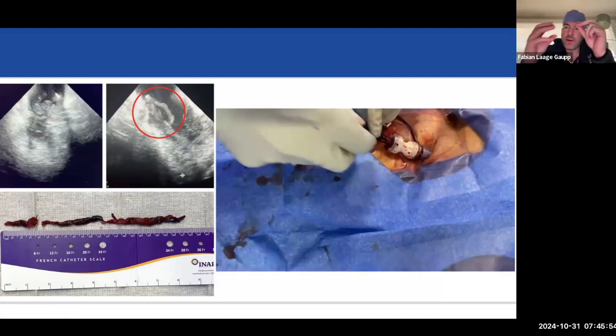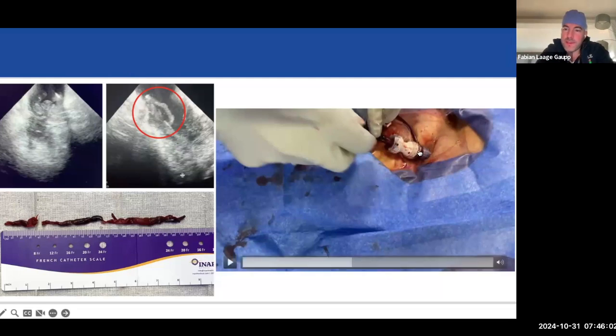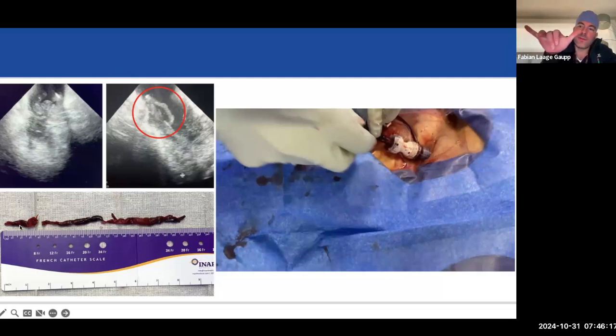it's not going in through the catheter, and your catheter just kind of latches onto the clot. So then you have to pull everything back together and then try to pull it out through the sheath. But sometimes the clot doesn't even fit through the sheath. So then you need to pull out everything over the wire without losing access, and remove the clot. All right, so you can see here in this case, this was a 20 centimeter clot, so it was about this long.